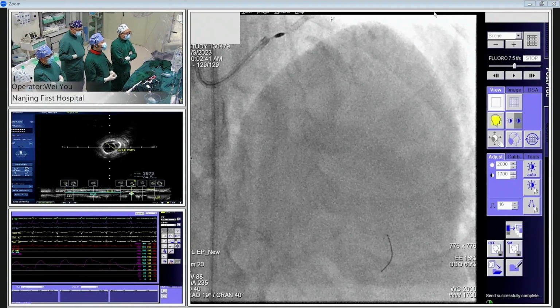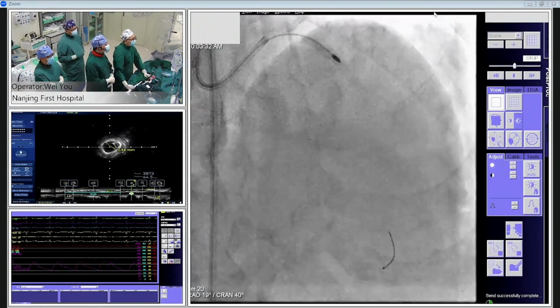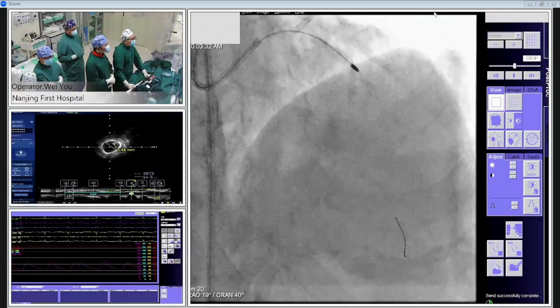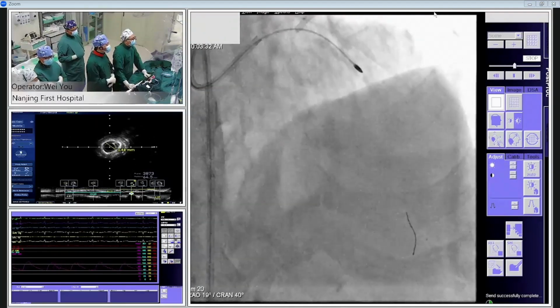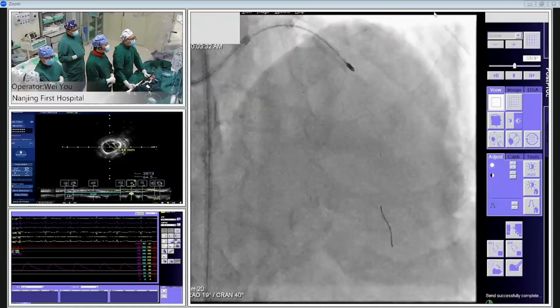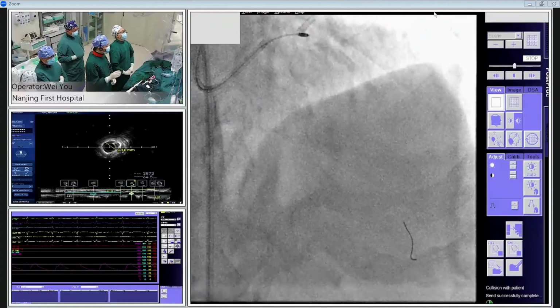Yes, third round. Okay, 30 seconds. The third round is ready. Yeah, ready. 160,000. 5 seconds. 10 seconds. Okay, nice. Pass.